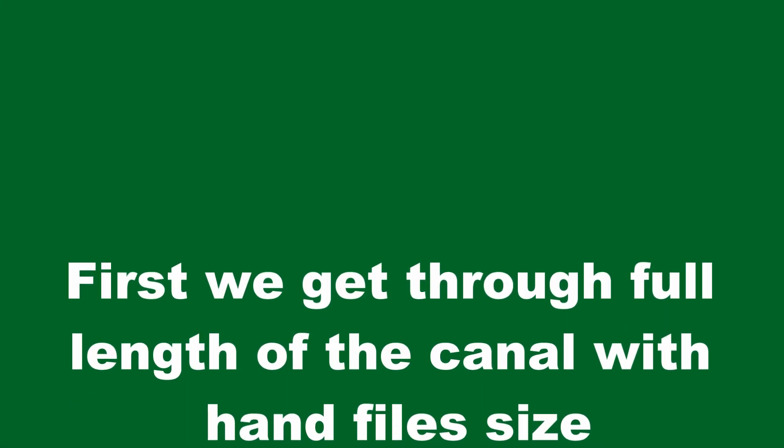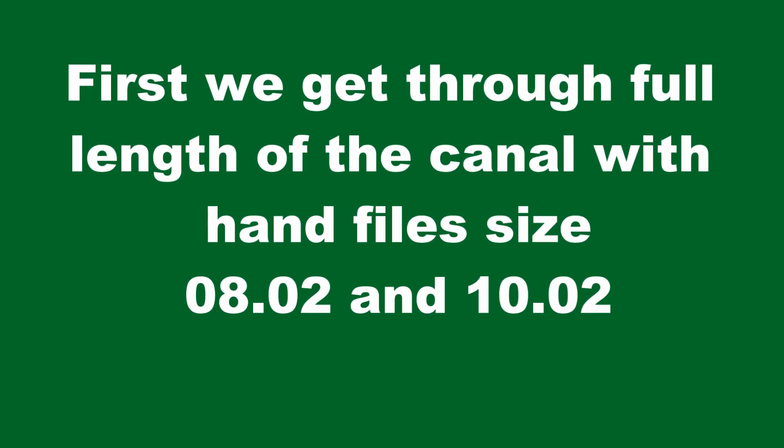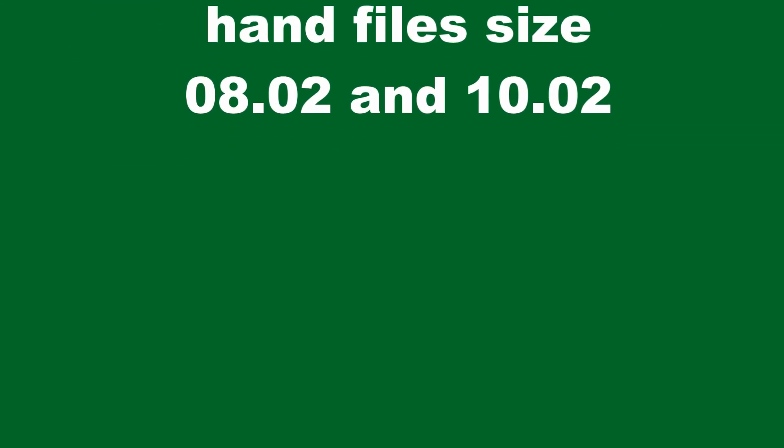First, we get through full length of canal with hand file size 08-02 and 10-02.